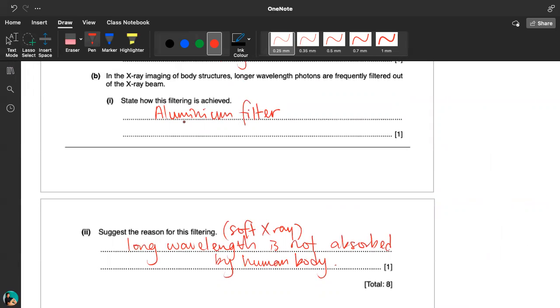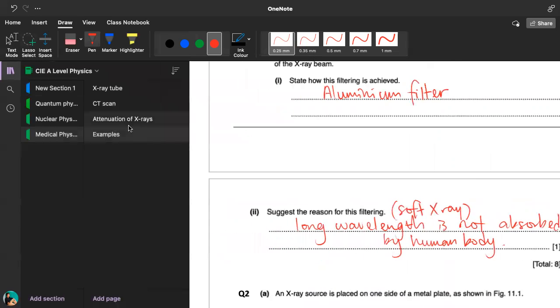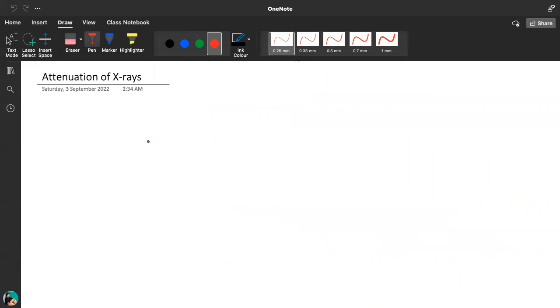So the first part is on producing X-rays. And what about the detection, like the formation of images? How is the X-ray image formed? Let's say you stand under the sun. The sunlight goes here, you block the sunlight, and then you see your shadow here.